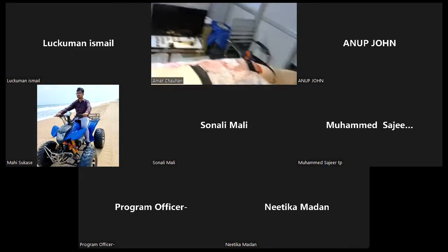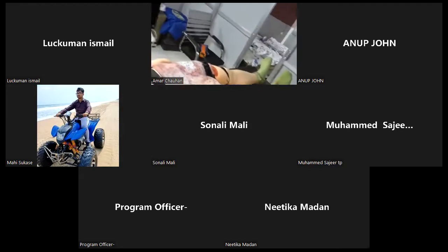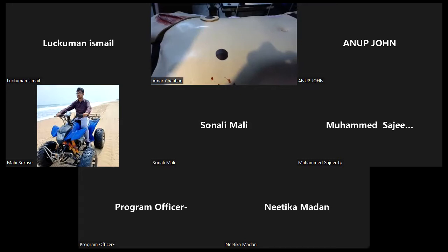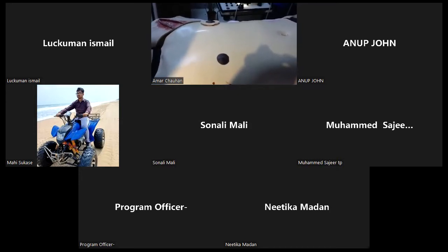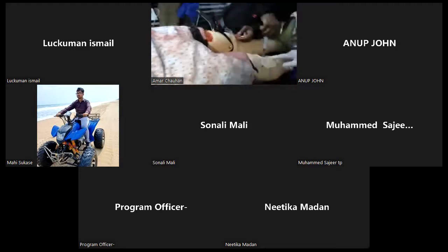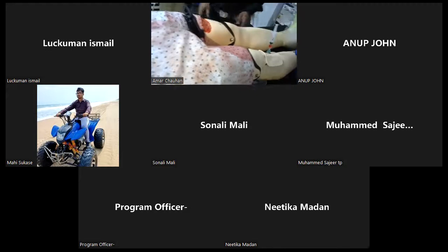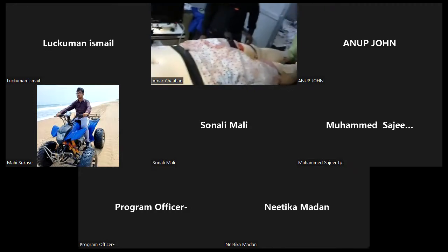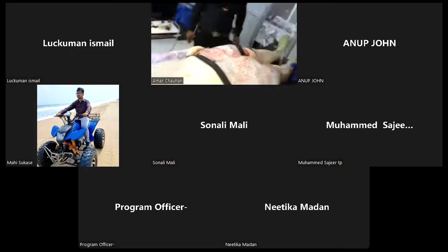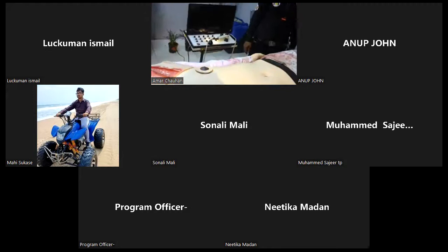So only multiple punctures, both facilities. Okay, so you can see the blood is coming, so you can start transfusion. When no veins are available, you can go for IO access. Now again, if the patient deteriorates and blood pressure goes down, then definitely we can suspect fracture pelvis.